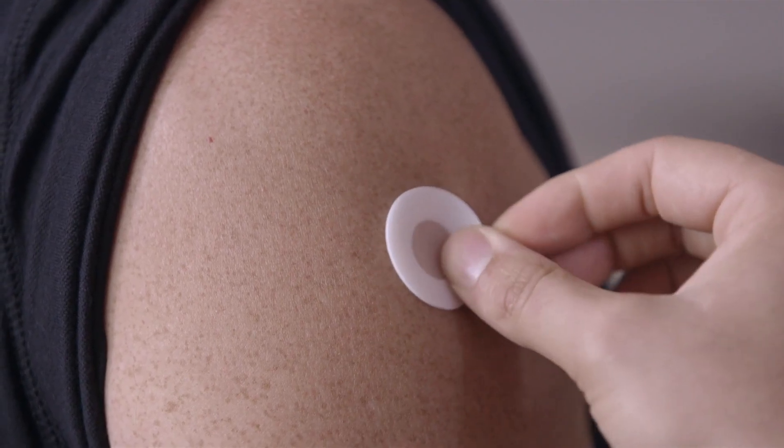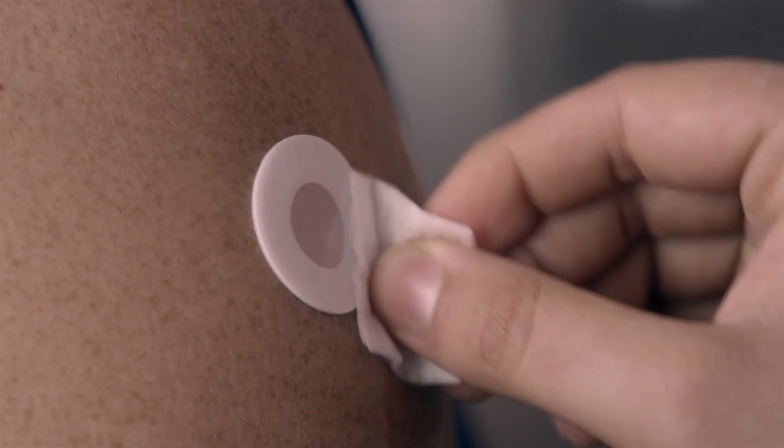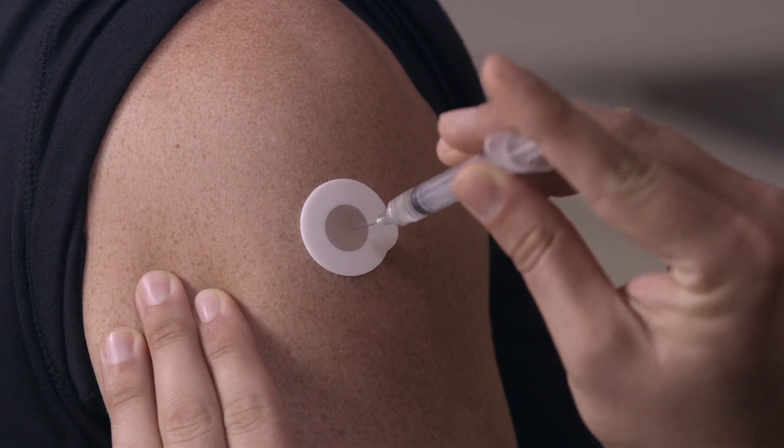Apply the InjectSafe Barrier Bandage to the skin without touching the membrane area of the bandage. Use an alcohol wipe to swab the InjectSafe Barrier Bandage. Then inject the needle in the center of the InjectSafe Barrier Bandage.